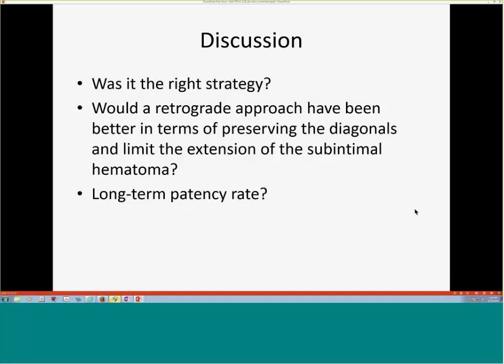No, go ahead, finish and I'm going to ask you a question. In my mind, the cleanest way to solve this would be to go retrograde. If you get a chance, maybe try 5 to 10 minutes going retrograde from the right. If you can get the connection, that would be the cleanest way; then you definitely solve it, and everything will be simplest. If not, I would still try maybe with the Pilot 200, or actually I would probably try a STAR, like a Fielder XT, make a knuckle and push it all the way out.